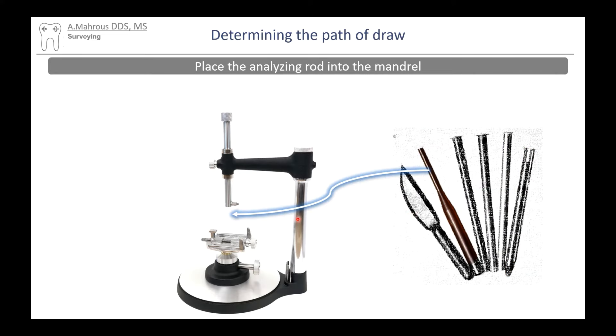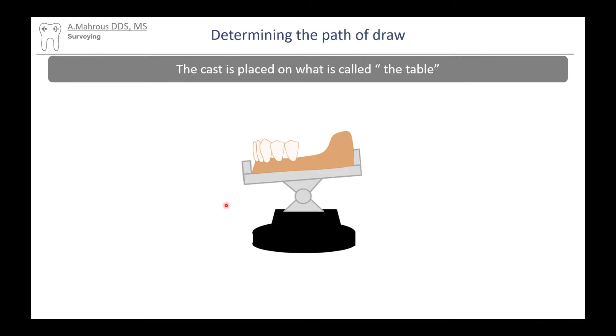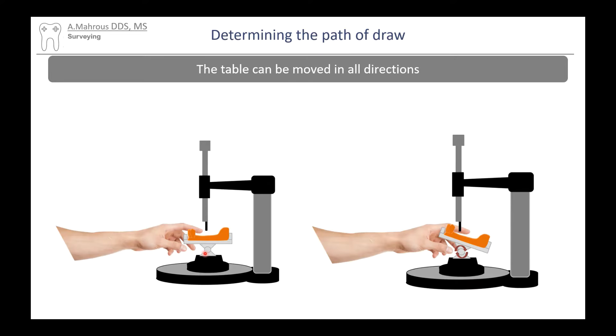We also have a carbon marker along with a lead shield. The first thing we're going to do is place that analyzing rod into the mandrel, which is this part right here. We're going to place our cast onto the table, this instrument right there. That table allows you to move your cast in all directions around all axes, thanks to this universal ball joint right here.